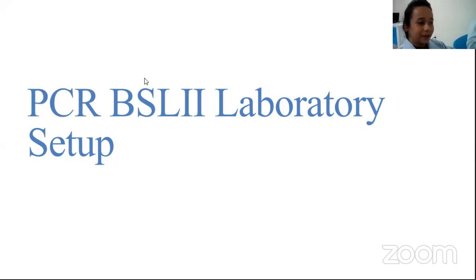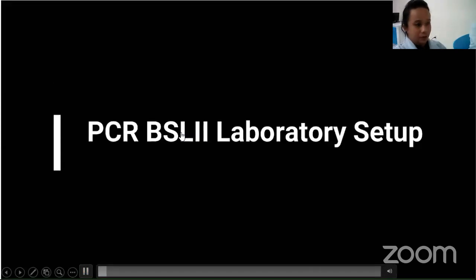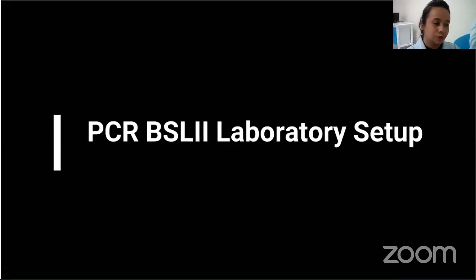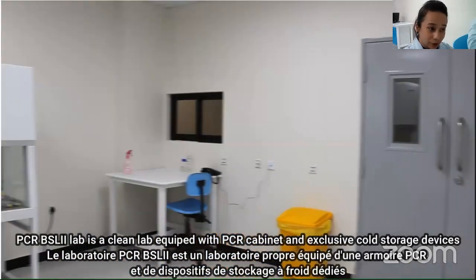To carry out PCR, especially when you are dealing with viral samples, you have to have a specific BSL-2 laboratory setup, a clean laboratory setup. Let's see what we have here at NIV to do the PCR for diagnostic purposes.